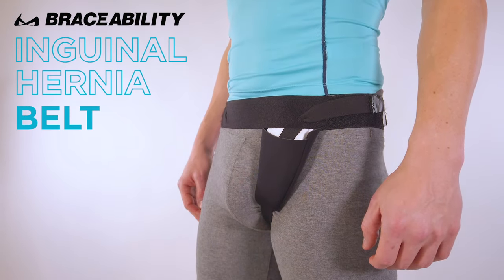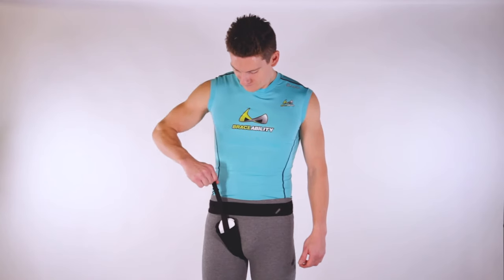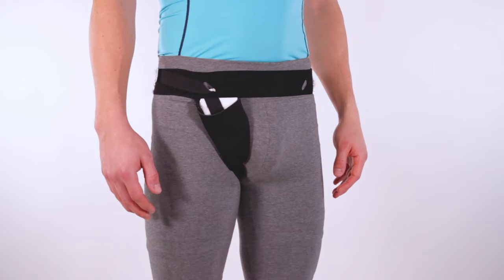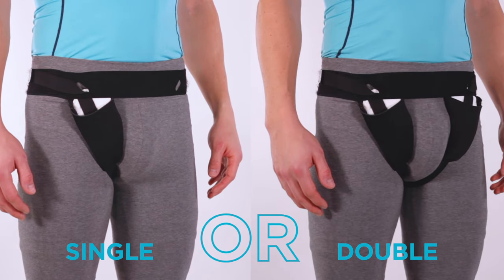Braceability Inguinal Hernia Belt. Use post or pre-surgery to provide constant, comfortable, and adjustable pressure to your hernia. Unlike any other support on the market, use interchangeably to treat single or double hernias.